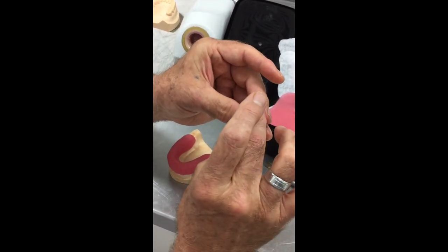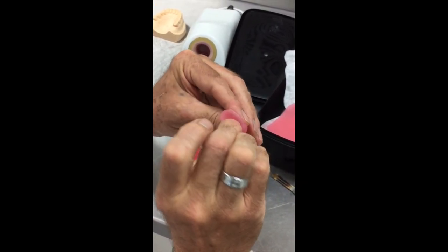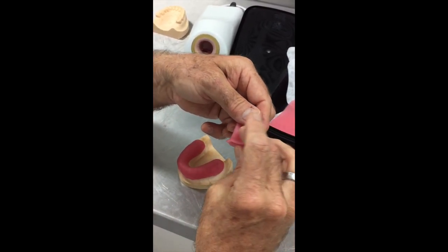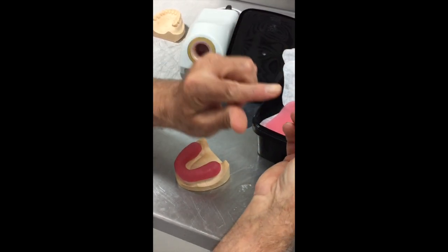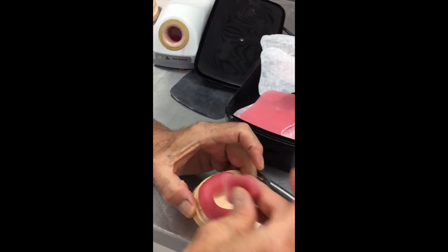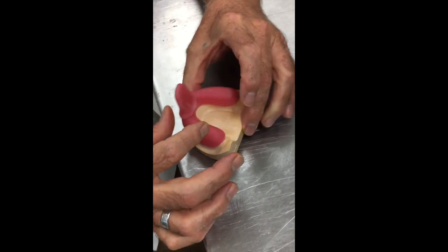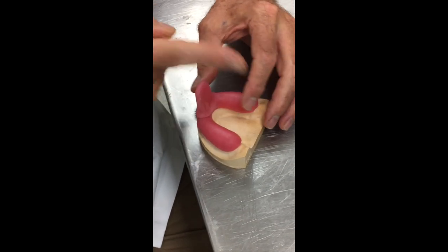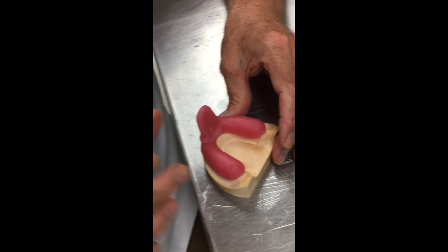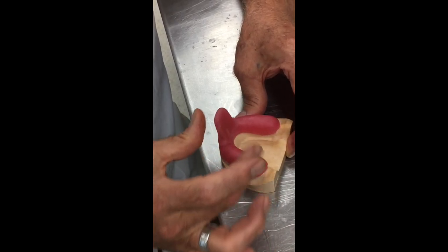A little trick that I use is to go around and now squeeze this out all the way around, like so, into a thin stage like that. That means that when we now position this on there, we have this large surface area of bonding, and so the handle is bonded strongly to the tray. So we sit that on there now, and it minimizes the amount of blending that we have to do. So I'm going to line that up right on the midline there, because that helps with the positioning of the tray. If we have it on the midline, we always get it in the right spot, and straight over the top of the teeth. And at this stage, I do not try to position the handle at all.